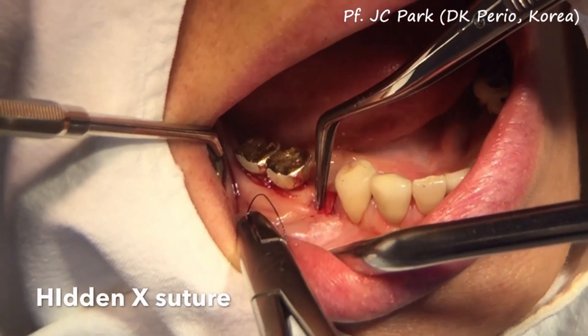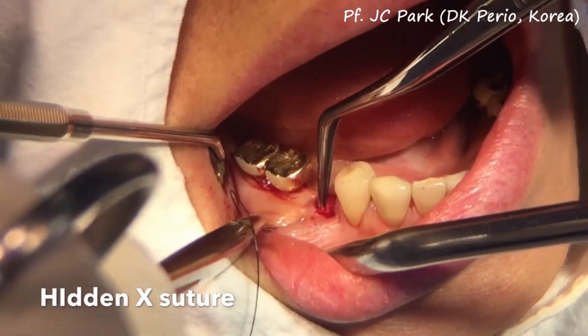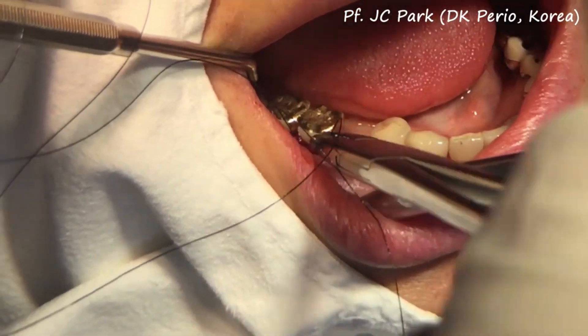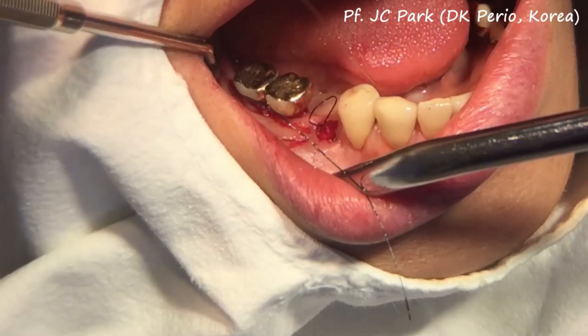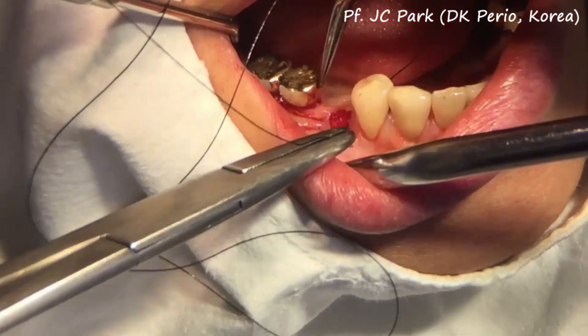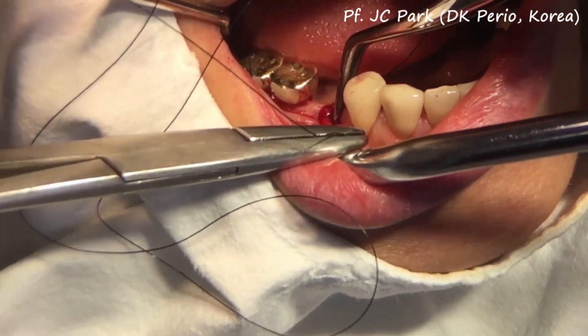Now you are ready to apply the hidden X suture, which is the ideal suture technique for open healing alveolar ridge preservation. After you enter from the buccal side in an oblique way, you come out from the lingual side.